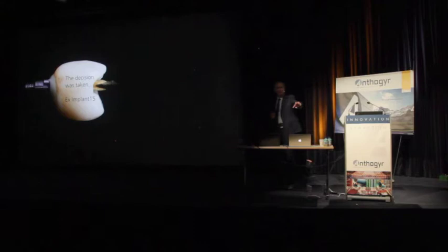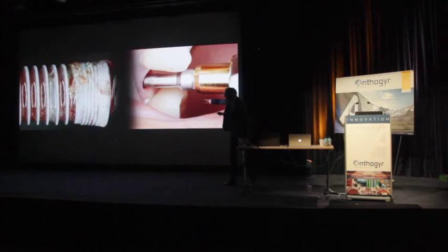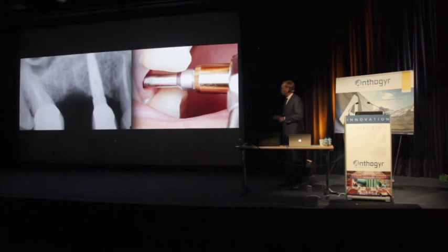of the bone. And here you can see the contamination of this implant. Very strange to see that the pathway of infection is not like a straight line, because here we have infection, we have two threads still integrated, and a third thread with bacteria again. So the bacteria can go through the bone like through a labyrinth sometimes. And this is interesting, and this is why it's so difficult to treat this disease.